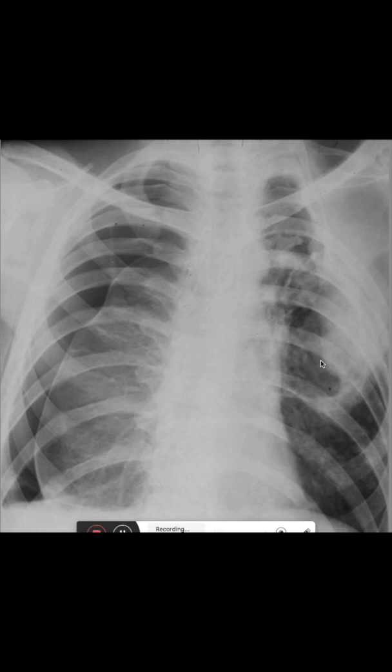We can also see that here on the right side there is a consolidation, which could be an infiltrate, pleural effusion trapped in the interlobium, or a space-occupying lesion. We want to make a repeat image in a few days to see how this lesion develops.